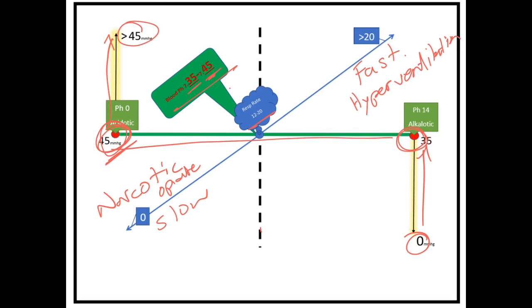If we have an opiate overdose and we put on end tidal, we should be expecting a number greater than 45, let's say 55. We see 55 and we're like, whoa, this is not good. We see a respiratory rate that's really slow, they're breathing 4 times a minute, and we're like, how do we correct this?